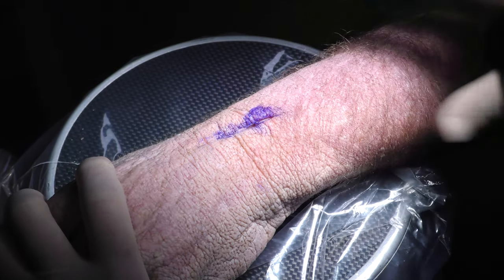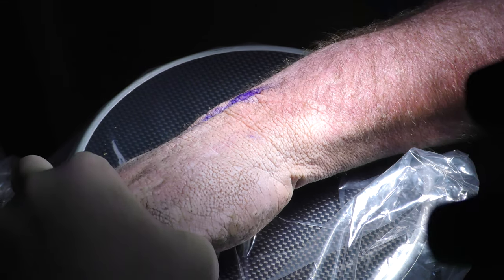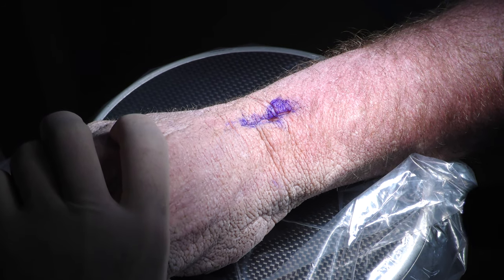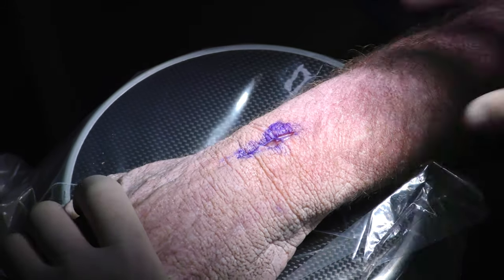I think that for non-displaced scaphoid fractures, this provides great stability, and these people will go on to union about 98% of the time or more. I have not personally had a non-union after percutaneous or small dorsal incision approaches for scaphoid fractures.